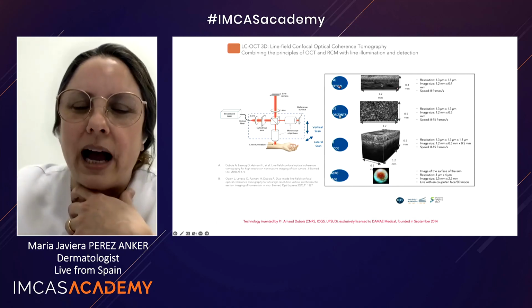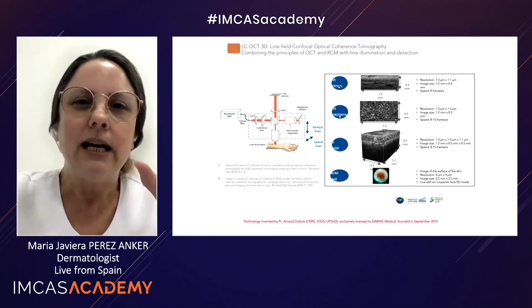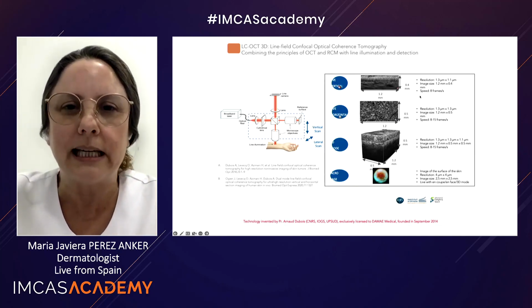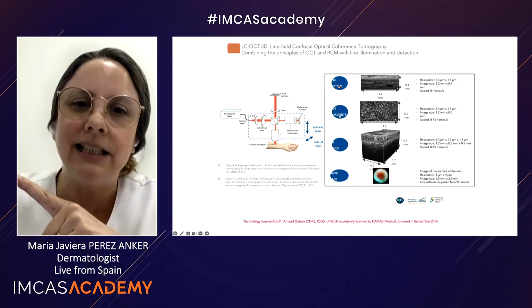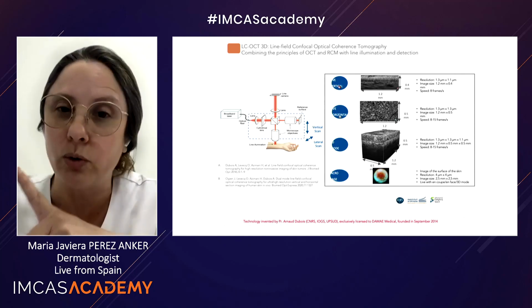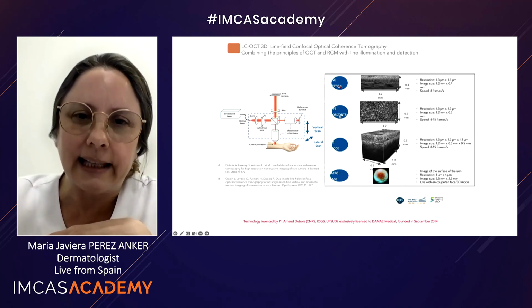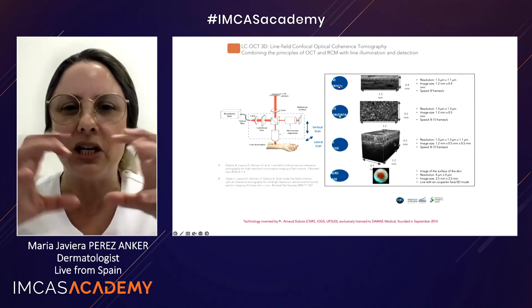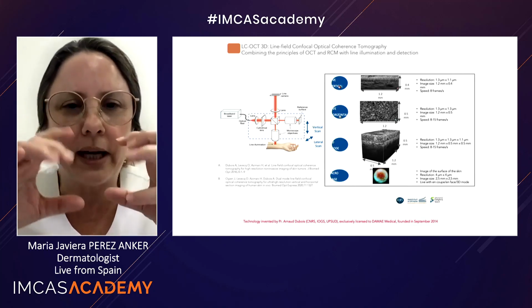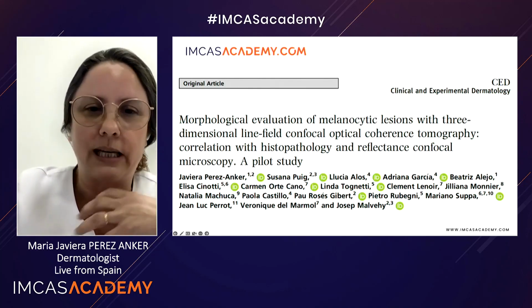So what is this? You have cellular resolution in vertical. For the first time, you can see in vertical view the detail of normal skin or tumoral skin with cellular resolution, and the horizontal view, exactly as confocal microscopy, with cellular resolution also. But what is more, we have the fusion of this, and we have this block in three dimensions, where we can see, to more or less 400 microns, the epidermis or whatever, the skin in 3D. So it's amazing.